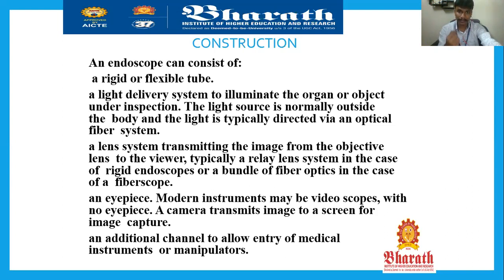The light transmitted inside is regulated by the source outside the human body. From the outside source, light is given to the mounted endoscope which is inserted inside through the fiber optics.